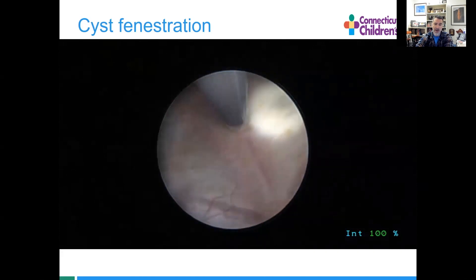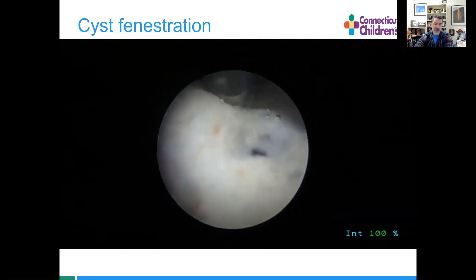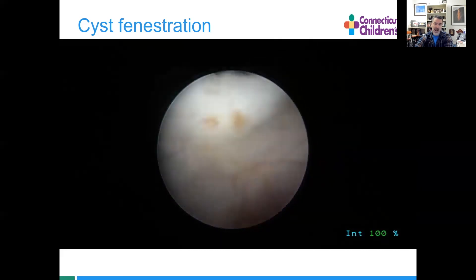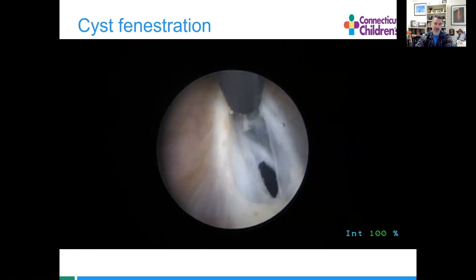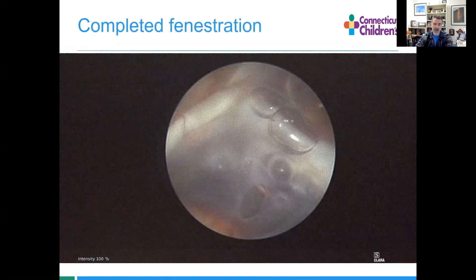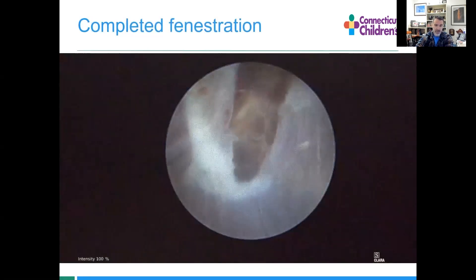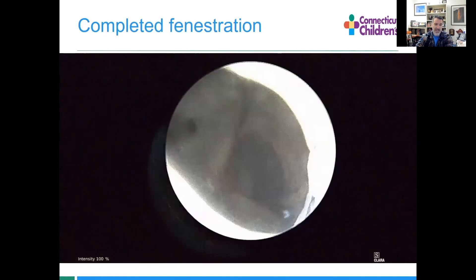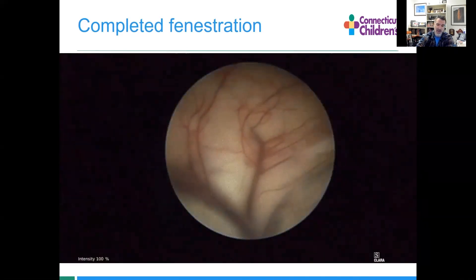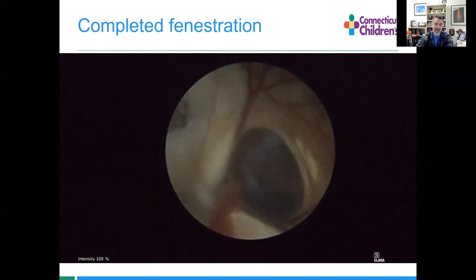Once we pop through, we can use traction and cautery to enlarge that hole — grabbing and enlarging it, pulling forward. We can see that's now away from the foramen of Monroe. We'll go through a septostomy here to look on the other side. Looks good — it's retracted away from the other foramen, so let's get out of dodge.